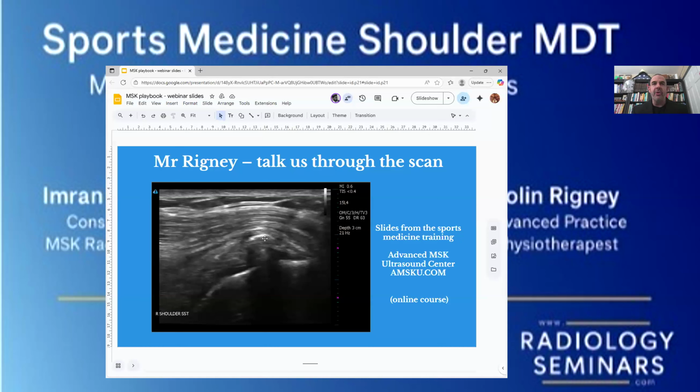So unlike Dr. Lasker, who is oftentimes doing this without a lot of clinical history on the back end of it, we're doing ultrasound at the point of care as an extension of our clinical brains. Okay, so a good physical exam history and a protocol sequence through the shoulder is going to lead us to ruling in and ruling out what's on our cluster findings from the exam. Okay, so ultrasound is not a replacement for any other image modality or your physical exam. It's another tool to use.